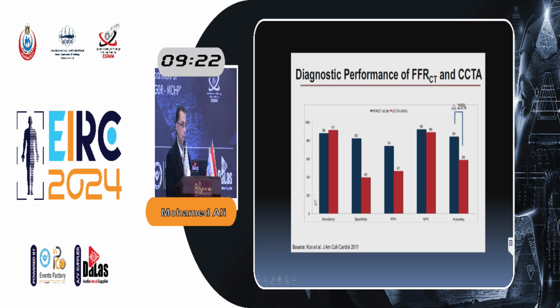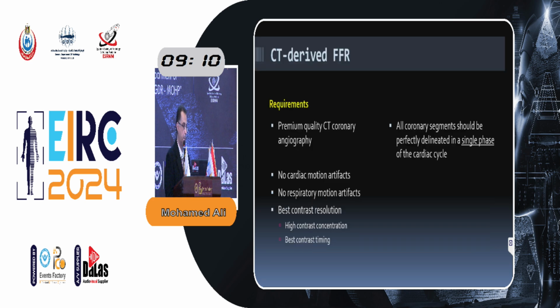As you can see here, FFR has significantly increased the specificity and positive predictive value of conventional CT angiography because of reduction of the false positive results.